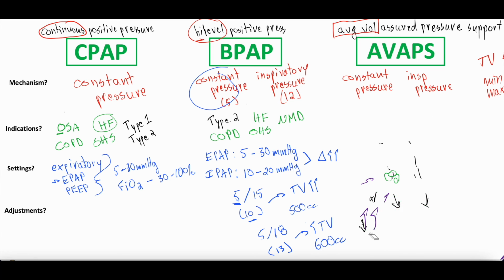And if you think about the inpatient setting, the hospital setting, and I see it all the time when I'm working in the ICU, you can really use BiPAP for almost anything you'd use CPAP for. You could use it for pulmonary fibrosis, inflammation of the lungs, et cetera, et cetera. So anyone with type 2 or even type 1, which is hypoxia, low oxygen levels, respiratory failure, you can trial BiPAP to see if it will help them.